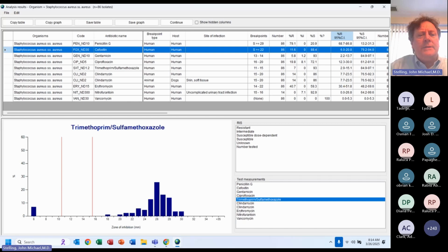Okay. Anything that you see here on the screen, you can copy and paste to Excel. I can save it as Excel. If I click on Save Table, I can say E. coli, RIS E. coli. Now saving it. When it finishes, it says the file is ready. Do you want to open the file in Excel? Yes, I do want to open the file in Excel.